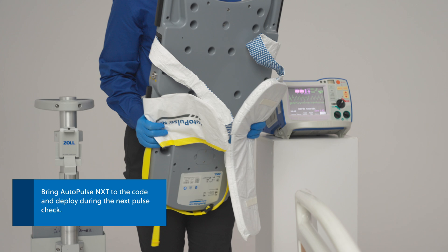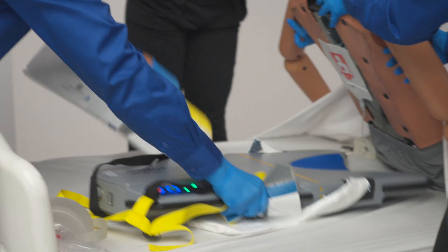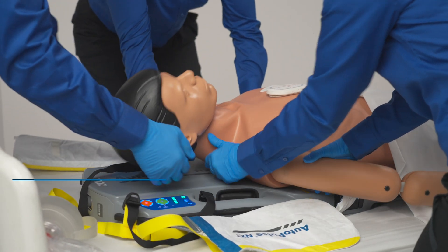Bring the AutoPulse NXT to the code and deploy during the next pulse check. Slightly elevate the patient's torso enough to fit the AutoPulse NXT platform between the surface and the patient. Lower the patient onto the platform.